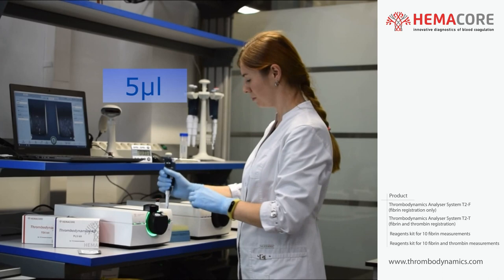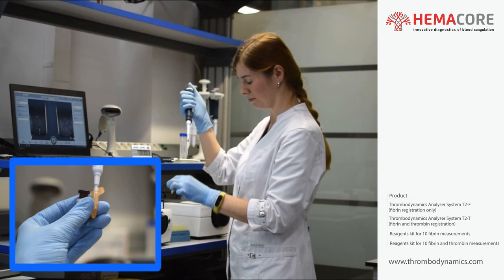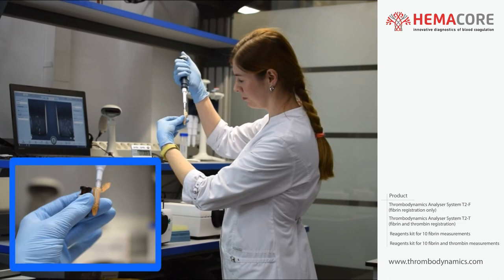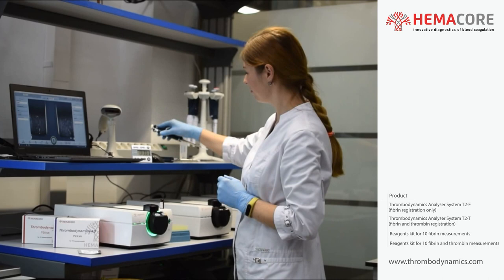Add 5 µL of the previously reconstituted reagent PLS to the tube with reagent 1 with plasma. Mix the contents several times via pipetting. Then add 6 µL of the reagent 1 with plasma mixture and place the tube back to the preheated place in the thermostat.